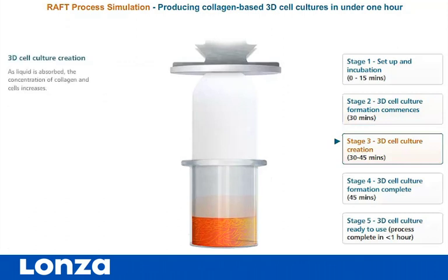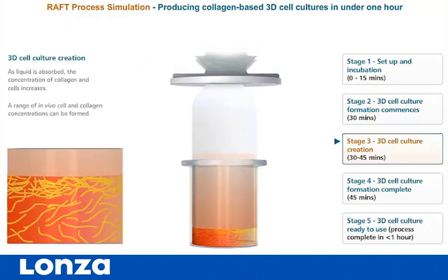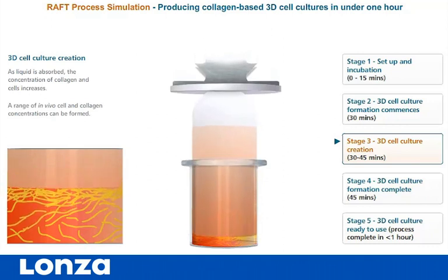Stage 3. 3D cell culture creation. As liquid is absorbed, the concentration of collagen and cells increases. A range of in vivo cell and collagen concentrations can be formed.